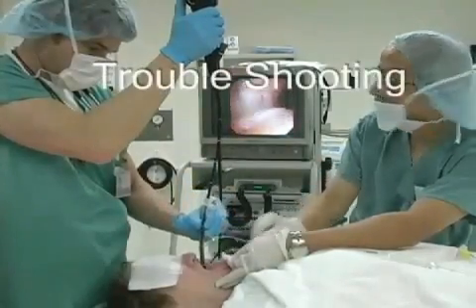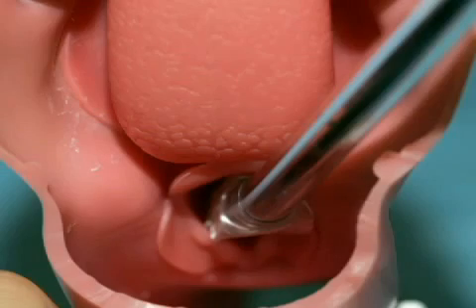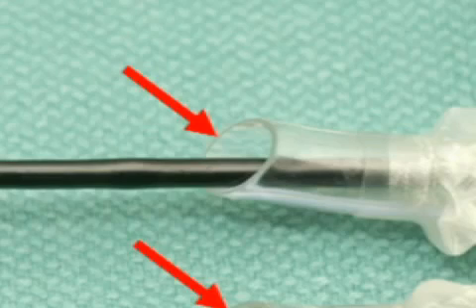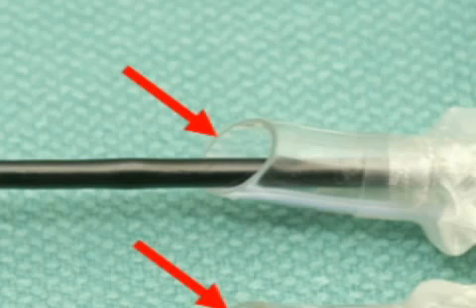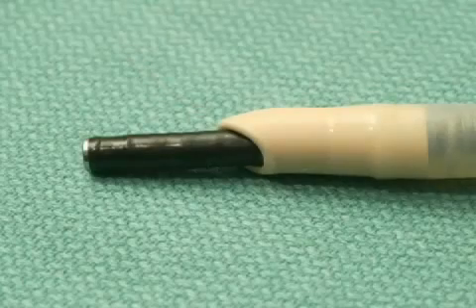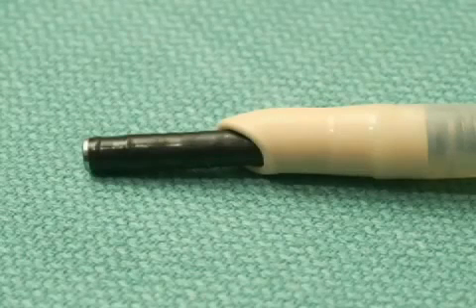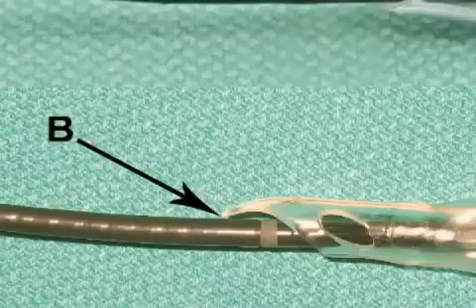Difficulty in passing the ensleeved endotracheal tube through the larynx may be encountered. Rotation of the tube 90 degrees counter-clockwise may improve passage of the tube through the larynx. The larger the discrepancy between the outside diameter of the bronchoscope shaft and the internal diameter of the ensleeved tube, the greater is the chance that the tube may impinge on laryngeal structures. Therefore, this discrepancy should be minimized if at all possible. Laryngeal cannulation may also be facilitated by using a tube with a modified tip design, such as the intubating LMA tube with a soft hemispherical bevel or the Parker Flex-Tip tube.